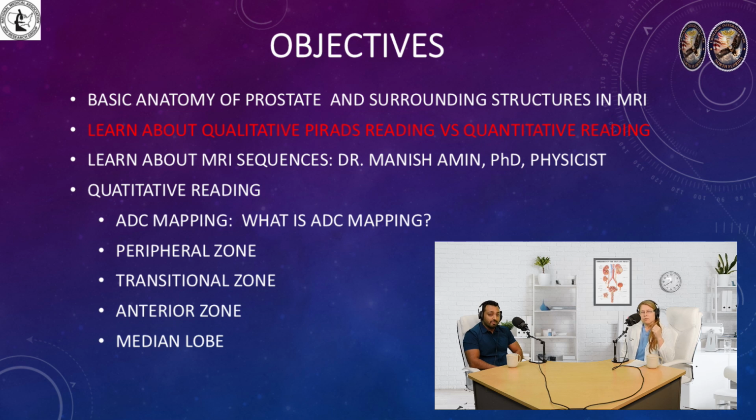Well, now I'm going to talk to you a little bit about the qualitative PI-RADS reading versus quantitative. We're going to start with qualitative reading. Next slide.